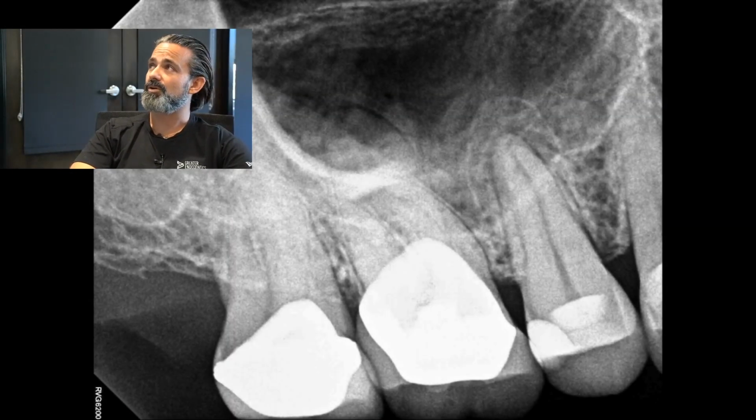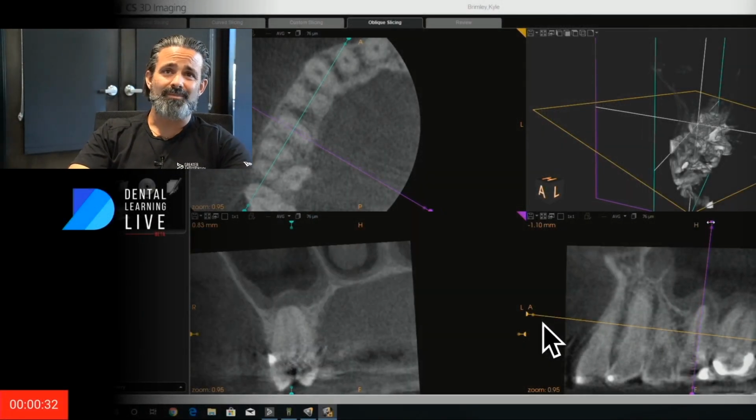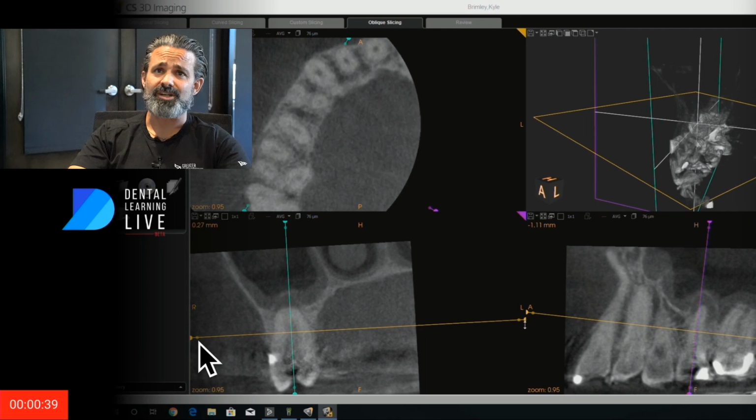Root canal number 4. When you look at this, you can see that the outline of the sinuses is up in here, and it makes you wonder, are we dealing with something that's directly into the sinus? So obviously a 3D exam would be paramount. Occlusally, we see a facial filling and a distal occlusal filling. But all in all, the margins look tight, so I'm not worried about leakage, and I want to keep my access as small as I can. Again, I can see the Schneiderian membrane.